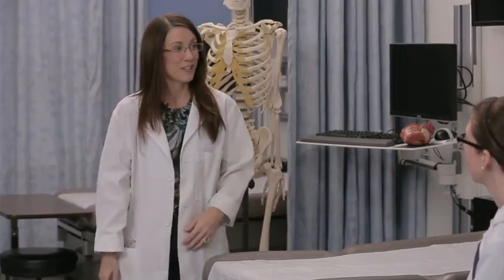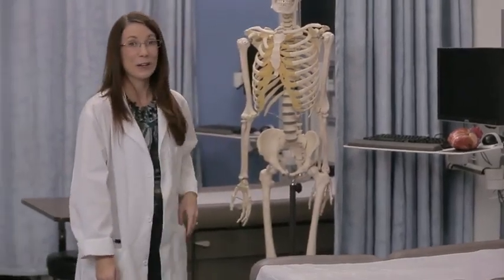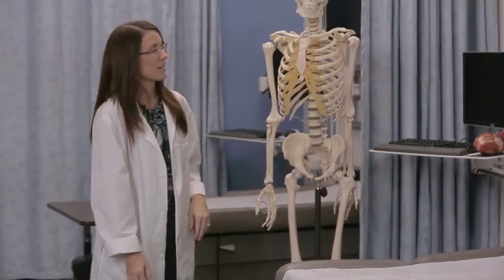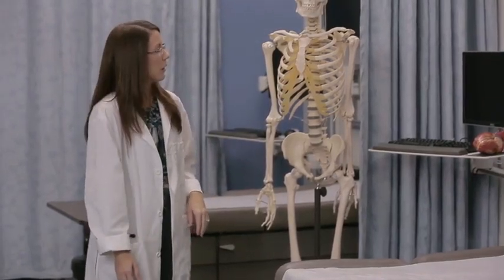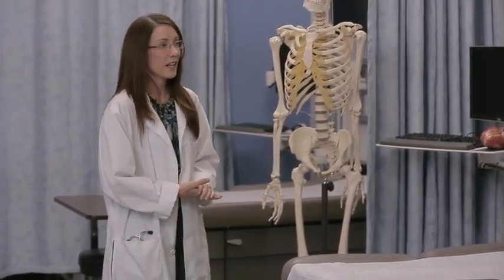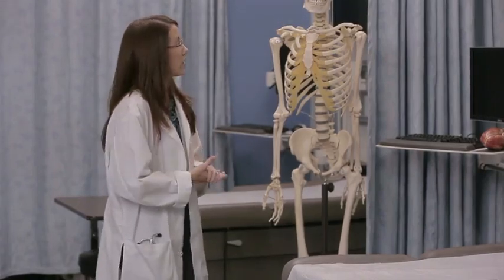Here we are in the simulation center, and Megan, one of our course instructors, is going to demonstrate the relationship between some basic heart anatomy and what clinicians listen for in physical examinations. What we're going to cover today is a review of the anatomy that Dr. Skanga has already gone over with you — the heart's position in the chest cavity — and we're going to learn about assessing the heart rate and auscultating heart sounds.